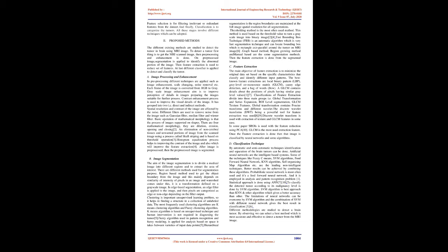Histogram equalization helps in improving the contrast of the image, which also improves feature extraction. After the image is pre-processed, the pre-processed image is segmented. B. Image segmentation. The aim of image segmentation is to divide a medical image into different regions and to extract the area of interest.